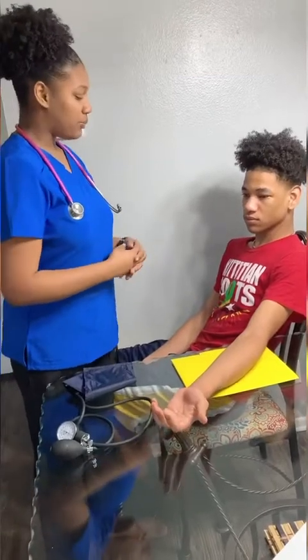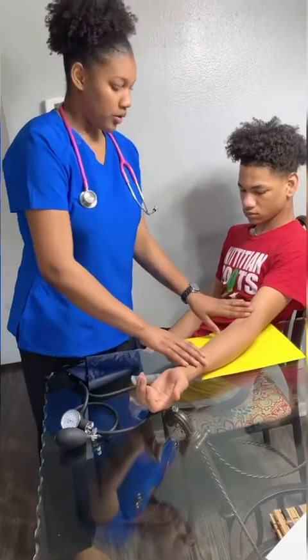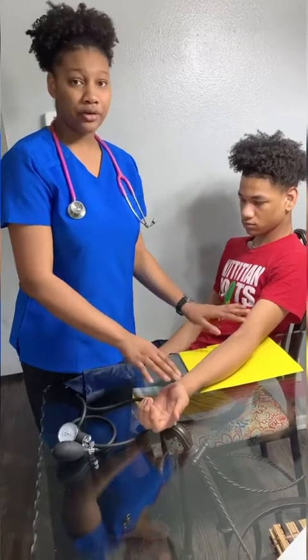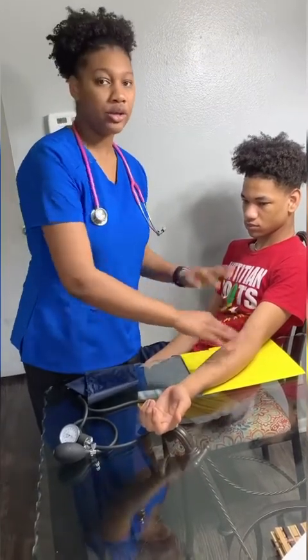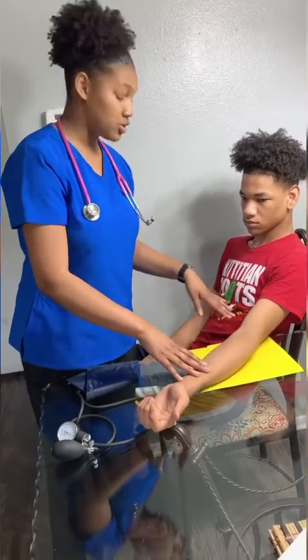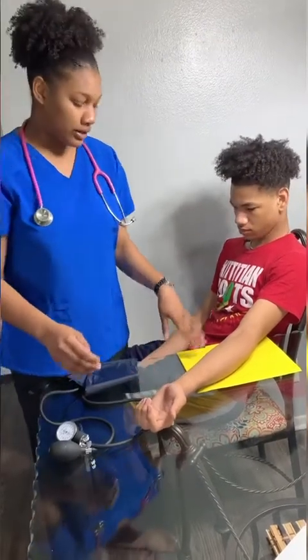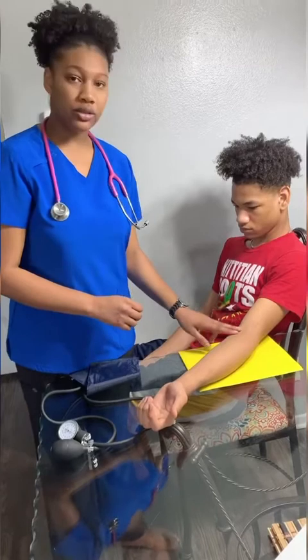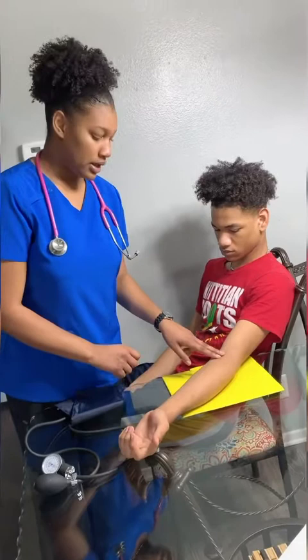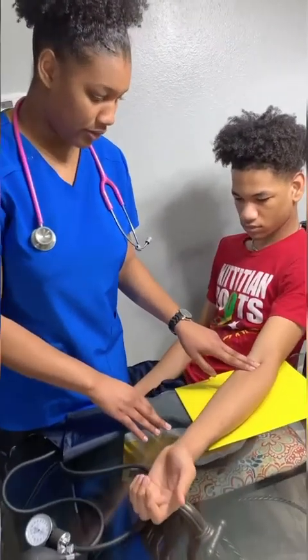Okay, so now I'll be taking your blood pressure. Could you relax your arm for me? Okay, so right now I'm taking the blood pressure. You want to ensure that the arm is bare, so no clothes are hindering, and that the arm is at rest in line with the heart. Now I want to feel the brachial artery. So I'll use the tips of my index and my middle finger. Okay, so I feel it, it's right here.